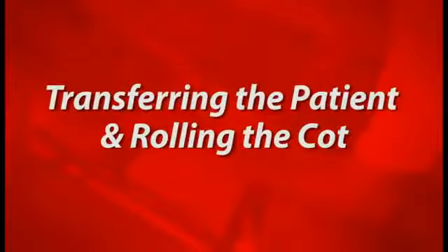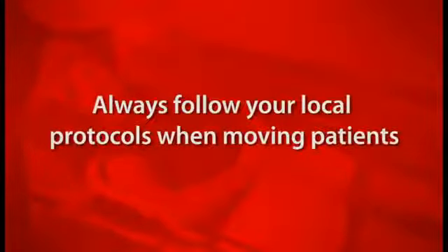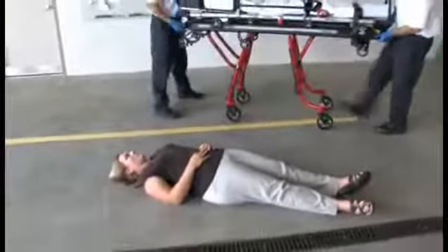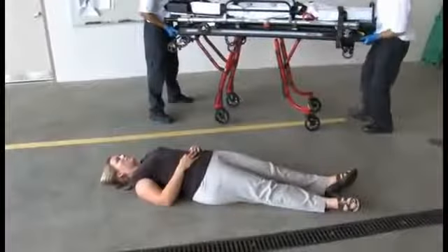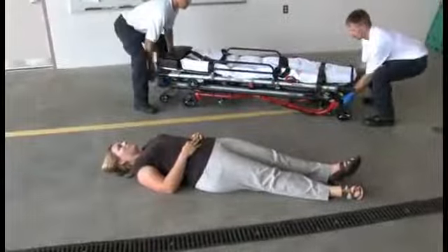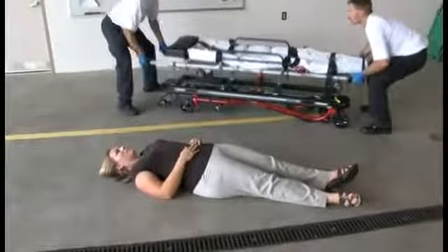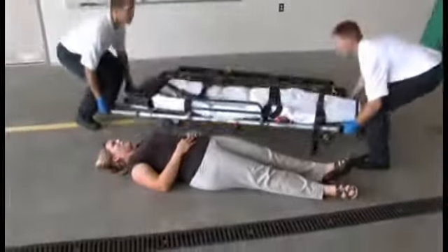Transferring the patient and rolling the cot. The following is a general procedure for transferring patients to the Mondial. Always follow your local protocols when moving patients. Place the transporter as close as possible to the patient. Engage the wheel locks and adjust the transporter to the level of the patient. You may also remove the stretcher from the transporter and place the stretcher next to the patient.